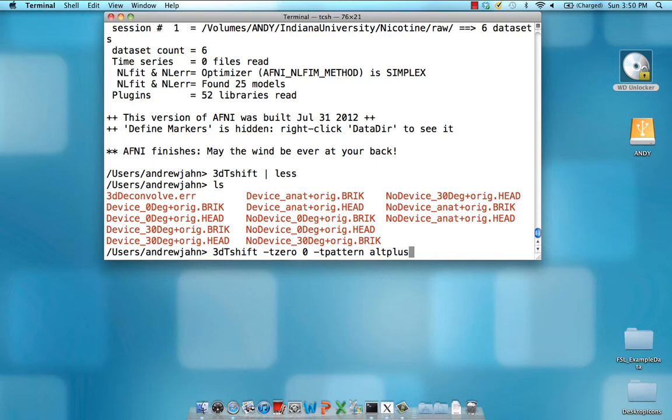This says that we start at slice zero, and we acquire every other slice. Once you get to the top for, say, all your even slices, go back and acquire all of your odd-numbered slices. Quintic is an interpolation method. It has its own flag, so there's no need to say dash interpolation, then Quintic. Just dash Quintic is fine.